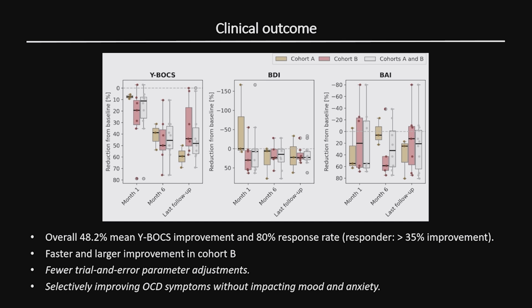Interestingly, we also see the selective improvement of the OCD symptom without any impact on mood and anxiety. Previous literature reports that when the patient showed Y-BOCS improvement, it also changed the depression and anxiety score. However, our results indicate that it selectively improved only the OCD symptom, without depression and anxiety.